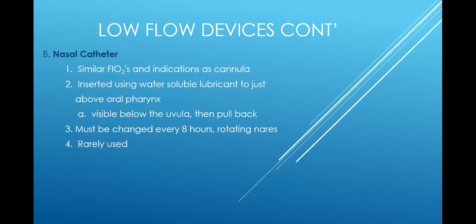Because the catheter is way back in the back of the throat, I can use less flow to achieve a higher FiO2 like that. Very rarely do they ever use this. Might be somebody who doesn't have ears or some type of way, but it's old. It's something they still talk about, but you don't see it anymore. Like I said, number four, rarely used.